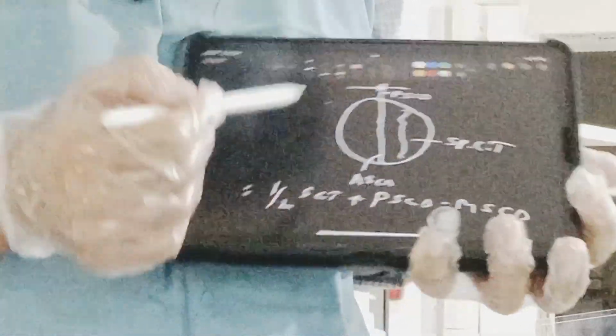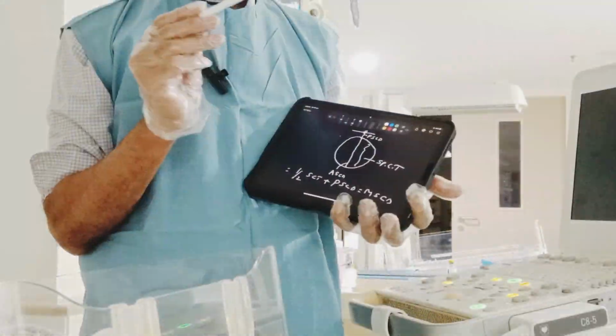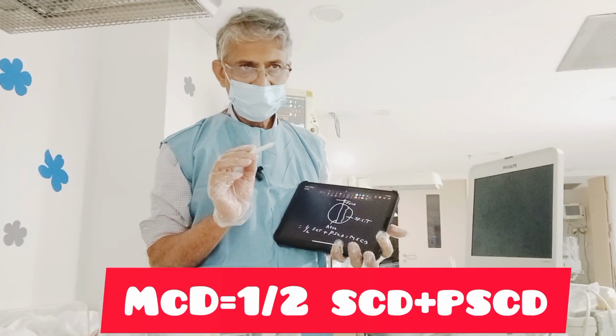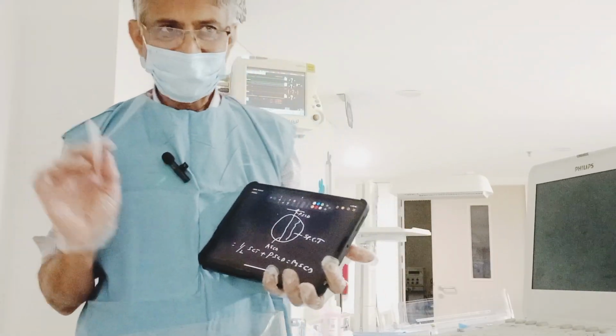So now this is the formula we use. What is the formula again? Mid spinal canal depth is equal to half of the spinal canal depth plus posterior spinal canal depth. Okay, let us see that one.